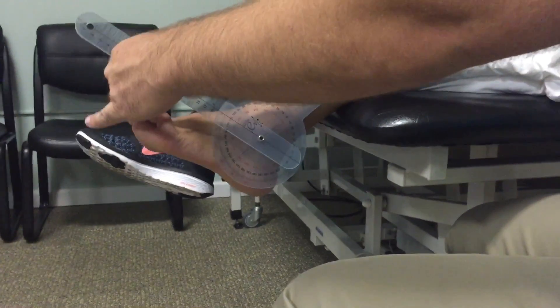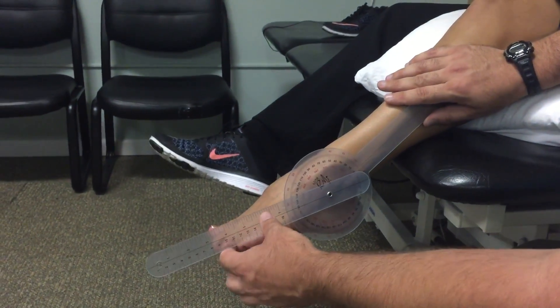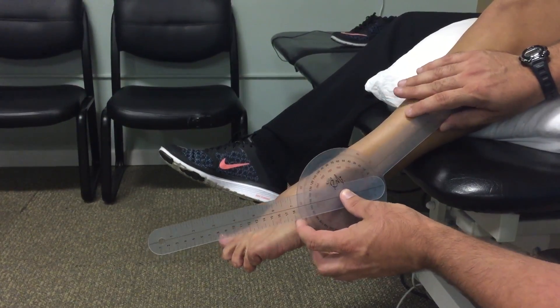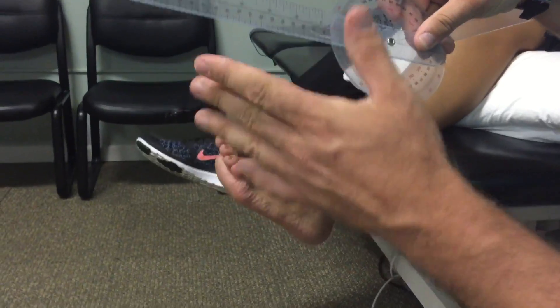Have the patient extend their foot down as far as possible. The movable arm will be parallel with the fifth metatarsal again, and you will get a reading between 50 and 60 degrees.